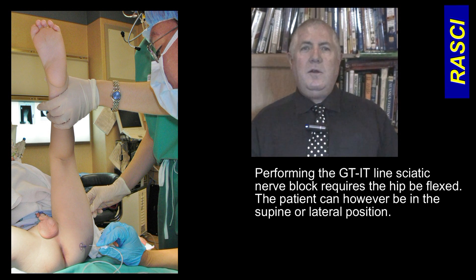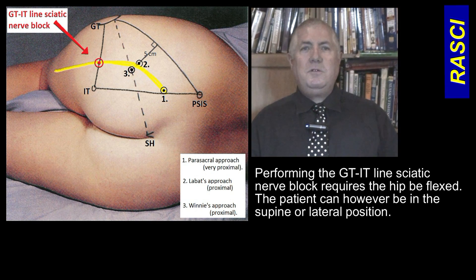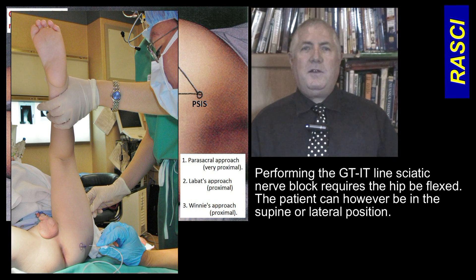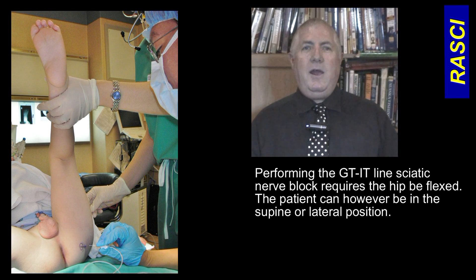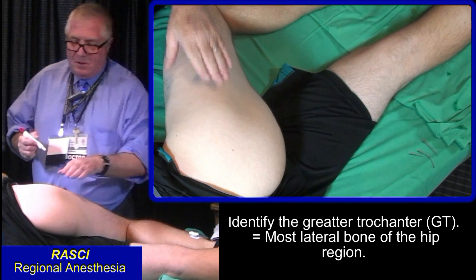First, flex the hip joint with the patient in the lateral position and the block side upwards. A supine position can also be used, supporting the legs in lithotomy in order to flex the hip, as is being done with this child under anesthesia. Let me show you the landmarks.